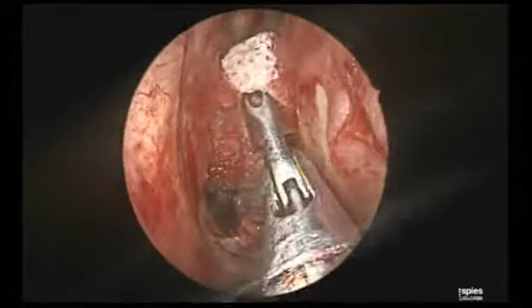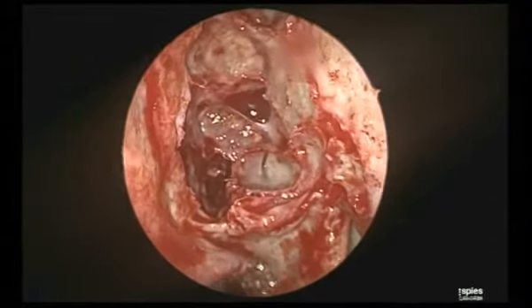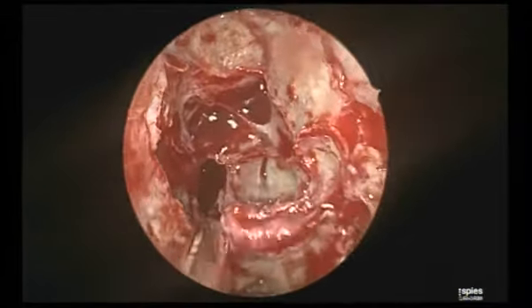The sino-nasal corridor is only this. Now see, Ashish, that is the posterior ethmoidal cavity now. Can you see?